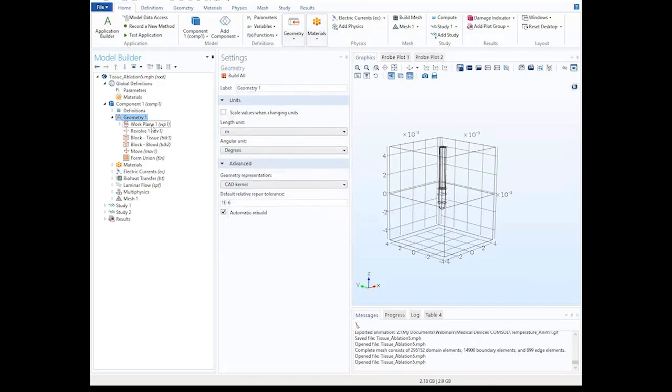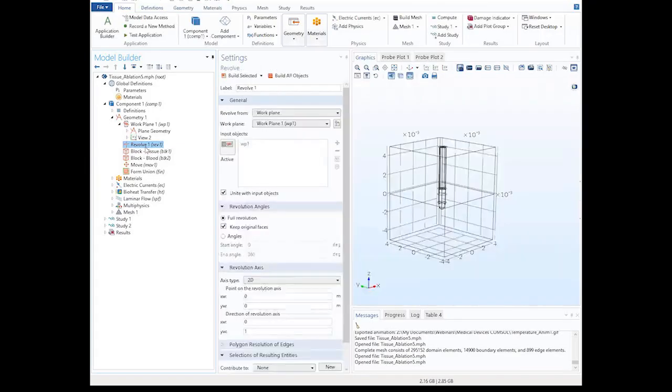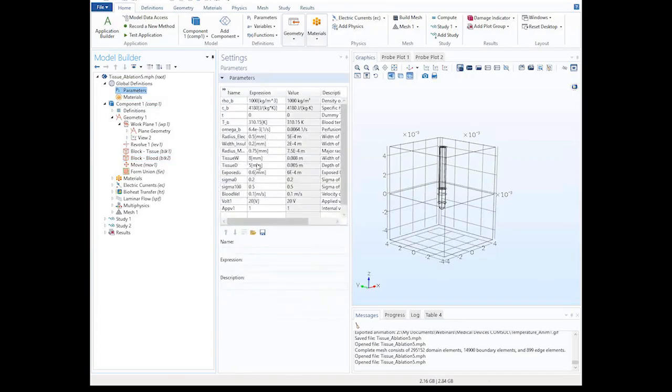It's pretty straightforward. I was able to do that here with just COMSOL, no imports of CAD. Basically, the electrode is drawn in 2D here, and then revolved, and then the block for the tissue and a block for the blood. And you'll see that the dimensions for most of these are given in terms of variables: tissue width, tissue depth, and these are parameters that you can just modify in here, rerun the analysis, and the model will be updated. I think I made it smaller than it should be, just so that it runs a little faster. So that is the geometry creation.